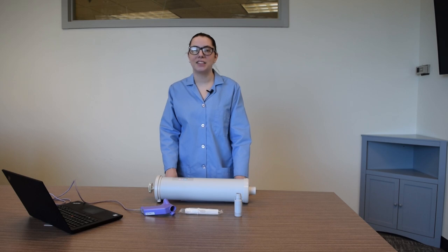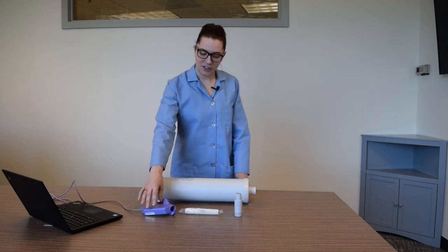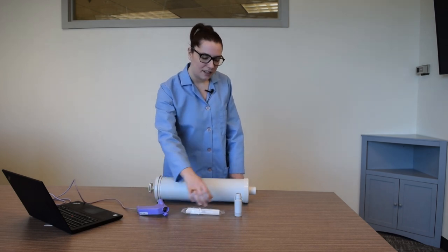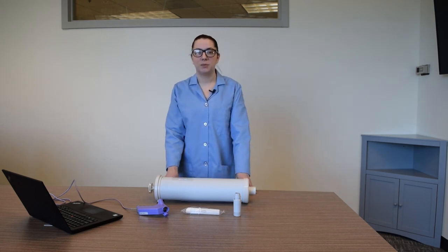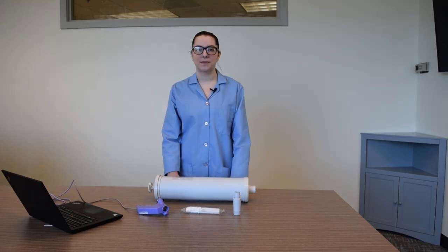Tina from NDD Medical Technologies, and today we're going to show you how to do a multi-flow calibration check using the Easyon PC spirometer. To begin, you'll need your Easyon PC hand sensor, a spirette, calibration adapter, and 3-liter calibration syringe. There are three different types of calibration checks: a single flow, multi-flow, and linearity. A multi-flow calibration check checks the accuracy at three different flow rates.